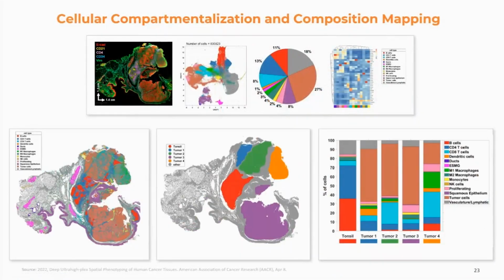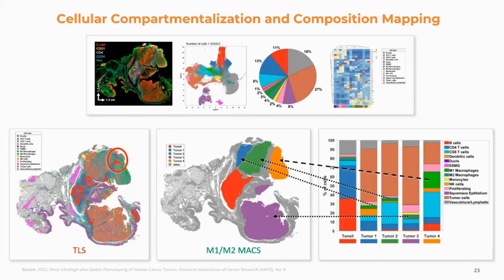When we look at the localization of immune cell subtypes, we can see that your M1 macrophages are localizing to this bit in the yellow, the area where you have your TLSs. The M2 macrophages are in the green, blue, and purple region. The M2s generally are immune suppressive. And so in 2 dimensions, you can start to appreciate this partial resistance to IO therapy. One being the presence of TLSs specifically in one area of the tumor, but absent in the other areas, but also this M1, M2 macrophage localization.